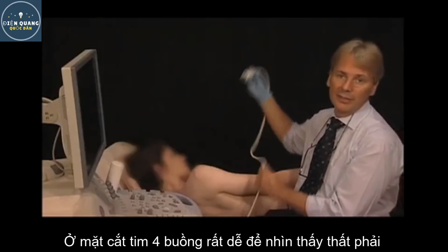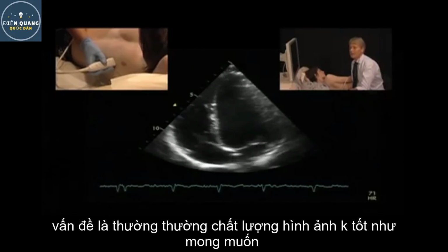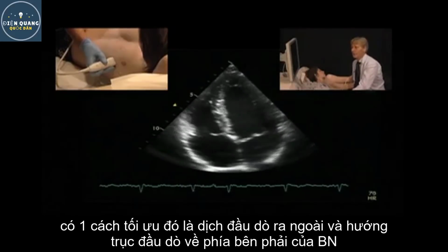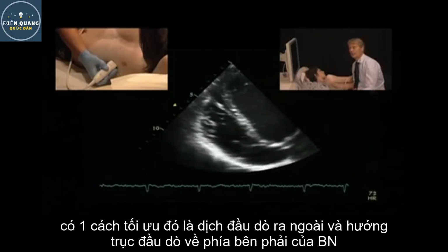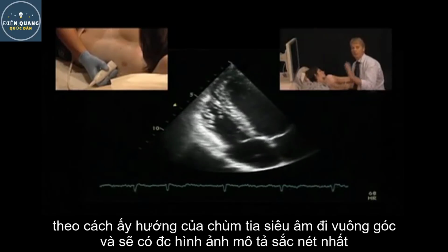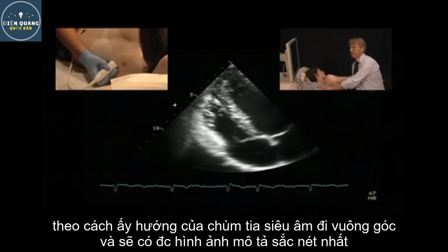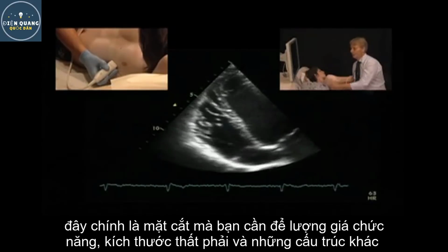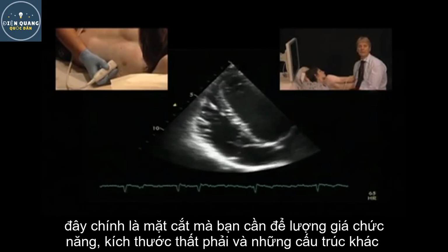In the four-chamber view, it's easy to see the right ventricle. However, very often the quality of the images is not as good as you would like them to be, especially for the right ventricle. There are ways of optimizing this view, and this is by simply moving the transducer more laterally and pointing the transducer more towards the right side of the body, and thereby you have a more perpendicular orientation of the ultrasound beams to the lateral wall, and you have a much better delineation of the endocardium. So this is the view that you can use if you really want to look at the right ventricle and to assess function, size, and further other things.